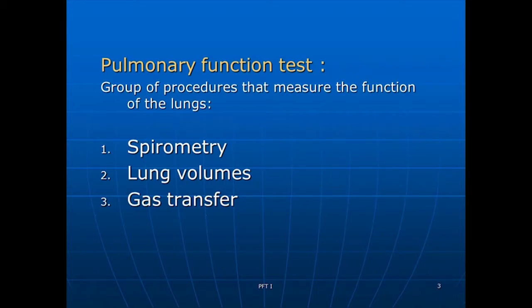And we're going to talk about this more, but obstructive lung disease has more problems with flow, and restrictive lung disease has more problems with volume. So when we look at the two, and there are spirometry values, usually the flow values for obstructive diseases are lower, and the volume values for restrictive diseases are lower. So again, we're looking at two things, flow versus volume in spirometry.